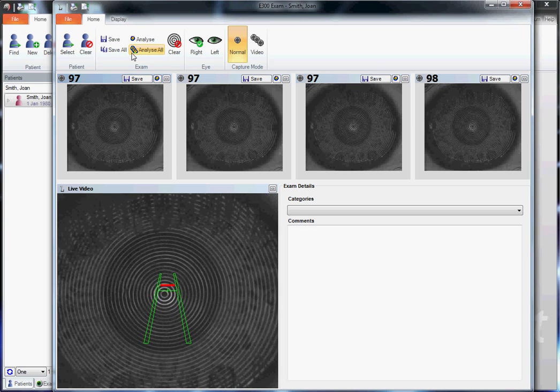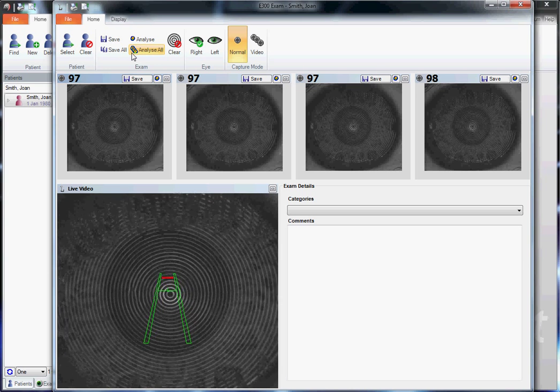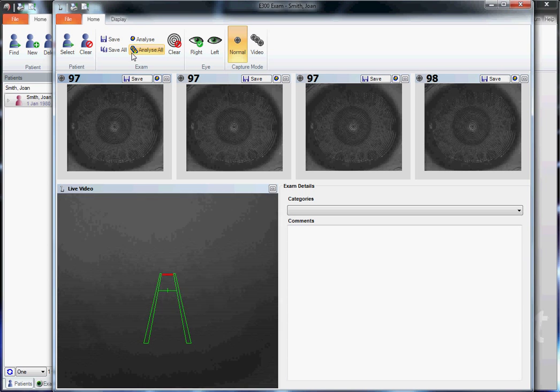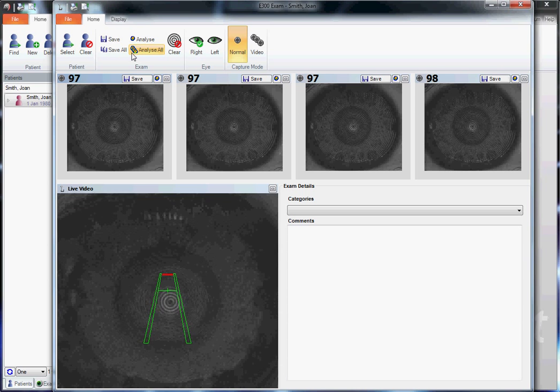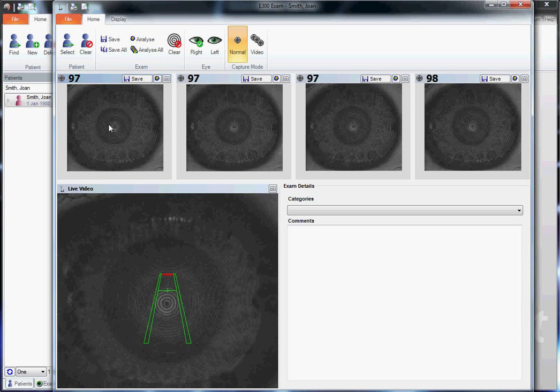like it is now with tear film breakup, let's ask the patient to blink, smooth out the tear film, and start again.